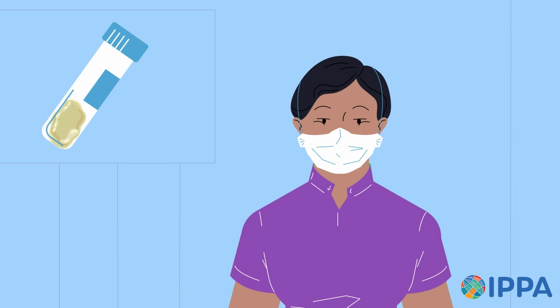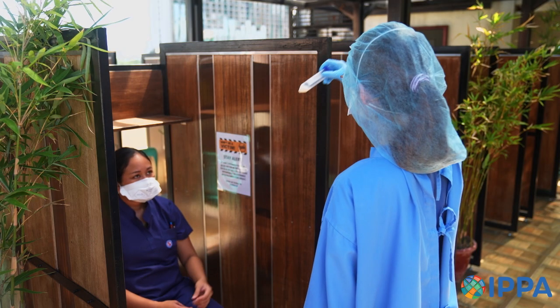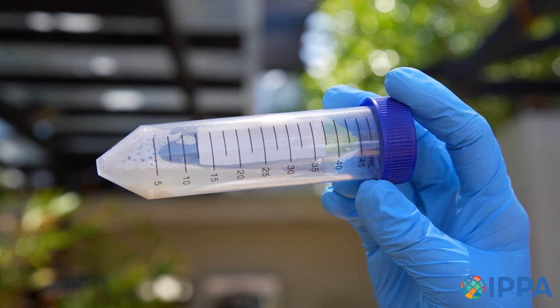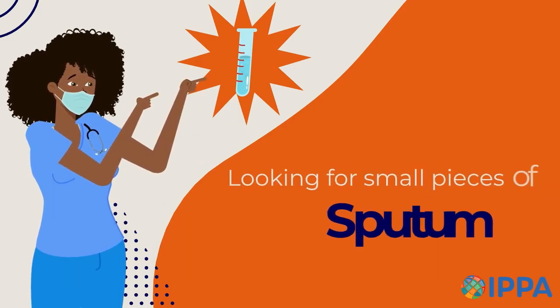Give the specimen container to the technician. The technician will hold the specimen up into the light and inspect the container to identify if they have a proper collection. The technician checks for sputum coming from the bottom of the lungs, looking for small pieces of sputum in the specimen.